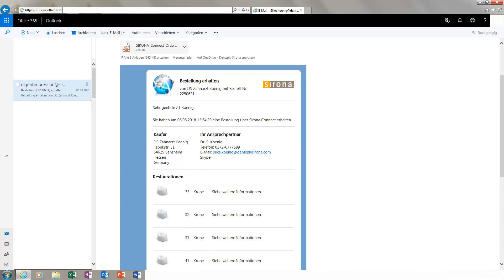At this point, you can either check the model data before accepting the case, or you can accept it directly without checking. First, we will go to the option of accepting the order directly.